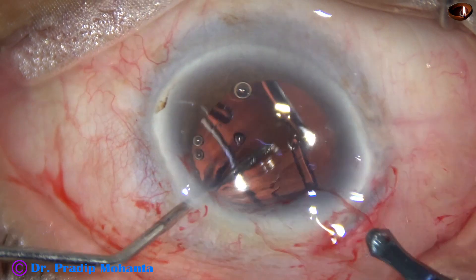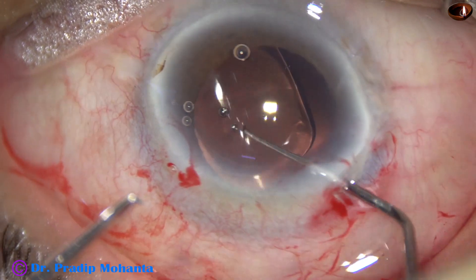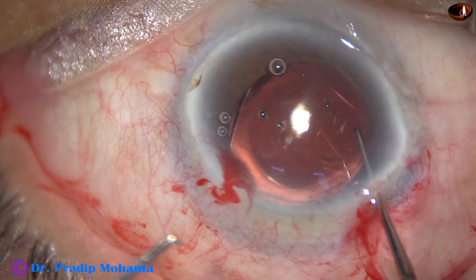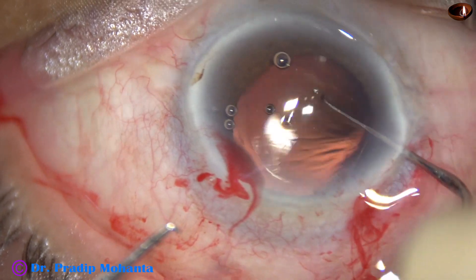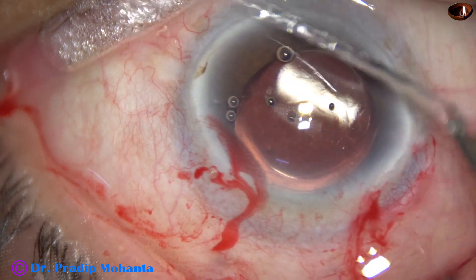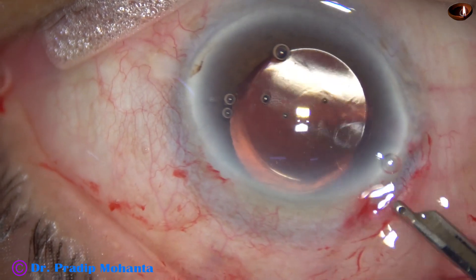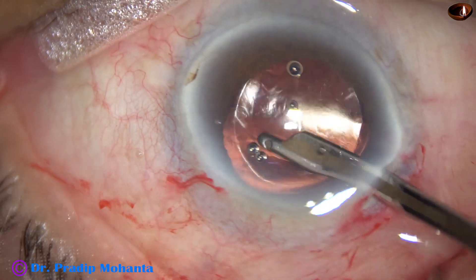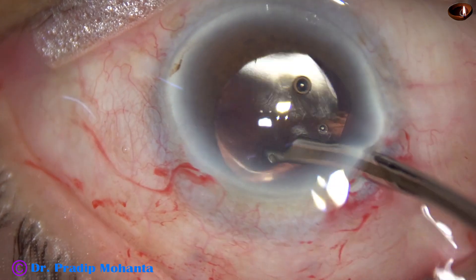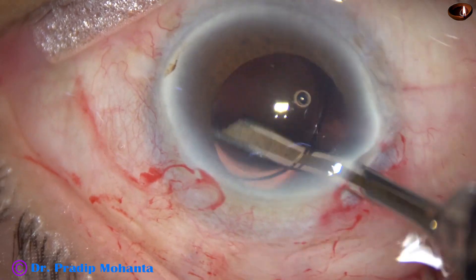Here it goes. And now the lens is dialed to place the haptics 90 degrees away from the main wound, so that I can go behind the IOL and irrigate the capsular bag nicely and remove all the visco molecules from the capsular bag. First, I go with the Simcoe cannula, irrigate the anterior chamber, and then push the nucleus — go behind the IOL and irrigate the capsular bag.